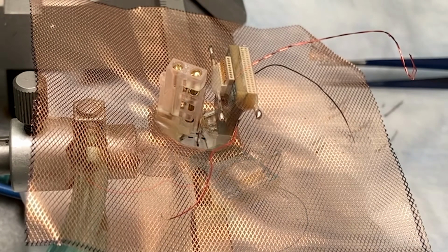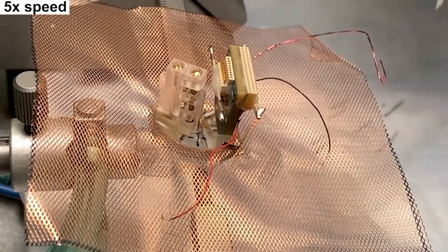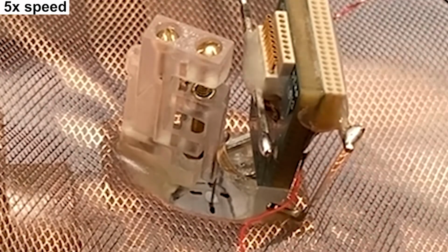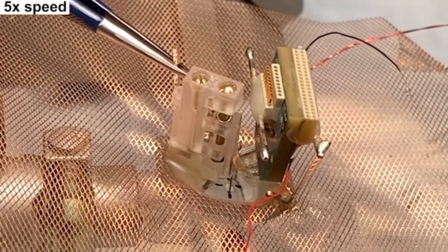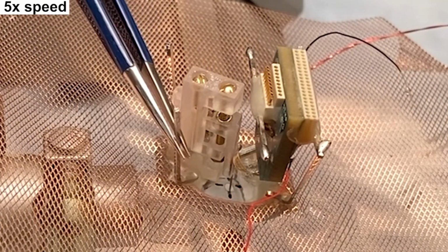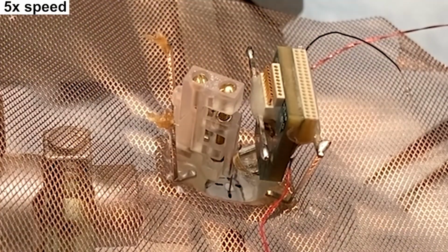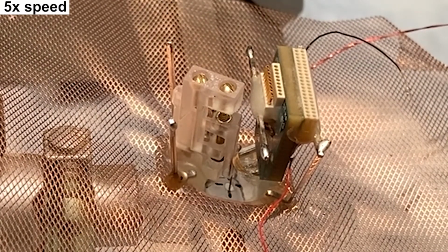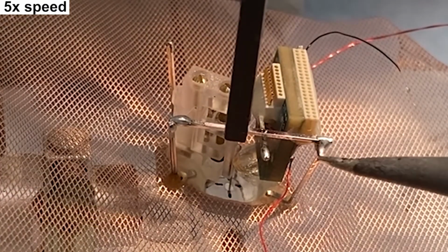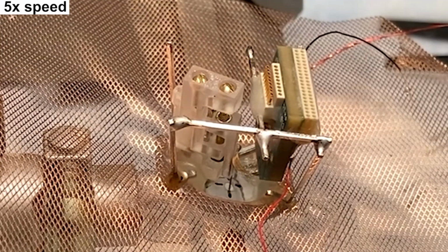And now the PCB is not in the way, so we can keep building all around. And as you see, I again just cover it with dental cement. And as a last step, I put solder on top of these metal bars, which will make the further soldering much easier. So basically we are building this metal bar cage around our device.